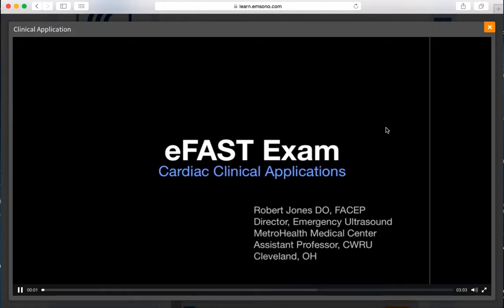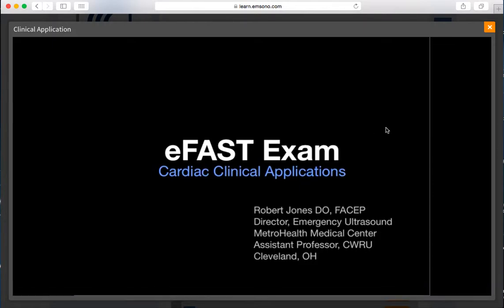I'm Dr. Robert Jones, and in this brief lecture, we're going to go over cardiac clinical applications of the EFAST exam. It's important to remember that the cardiac application, meaning the detection of hemopericardium, is one of the most important ones in the FAST exam. Studies have shown that the early detection of hemopericardium dramatically reduces the morbidity and mortality in these patients. So this is an area where you get the big bang for the buck when you perform the FAST exam.